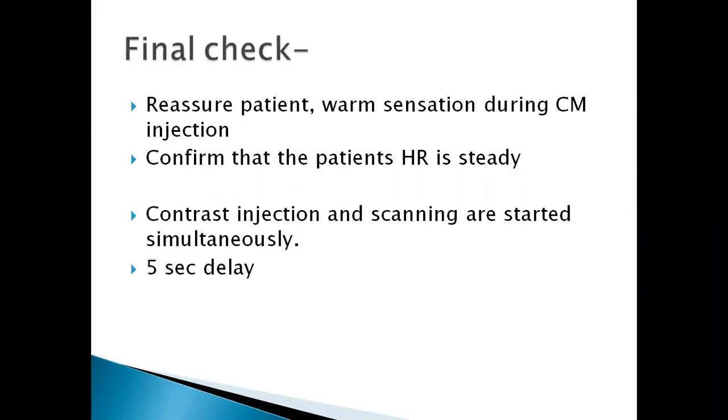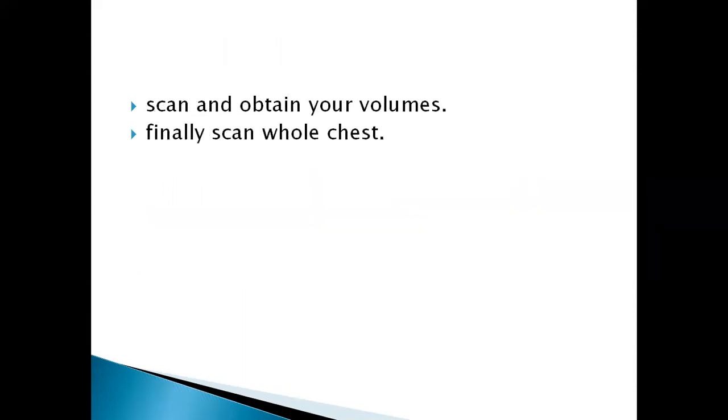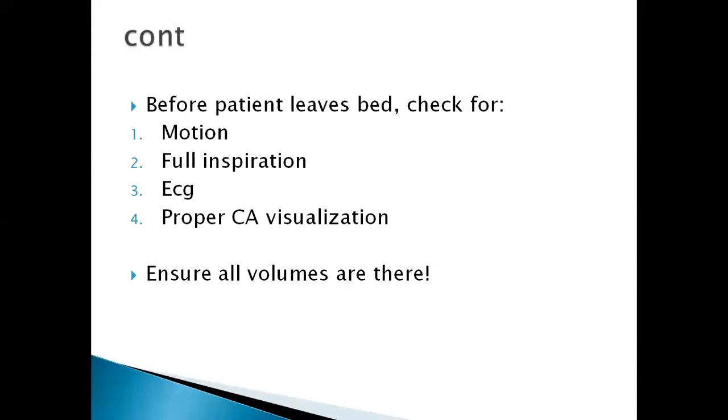But before you do a scan, reassure the patient, warn them and tell them about the warm sensation that they may feel when the contrast is going in, because if you don't warn them, again, they may get scared, which may disturb the heart rate. So if your heart rate is stable, you warned your patient and everything else is okay, then you may go ahead. Contrast injection and scanning are started simultaneously, but there's a 5-second delay before the scan can start. And then you obtain your volumes. After you obtain your volumes, finally you can scan the whole chest now. And then the examination is done.